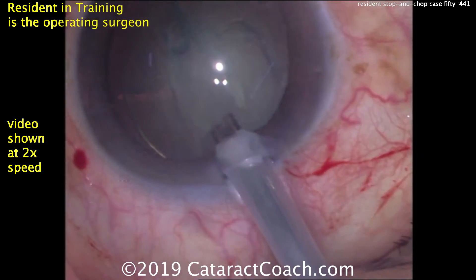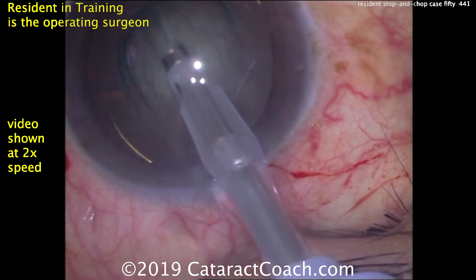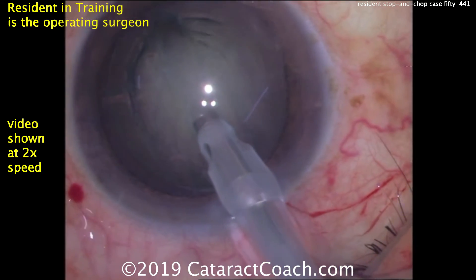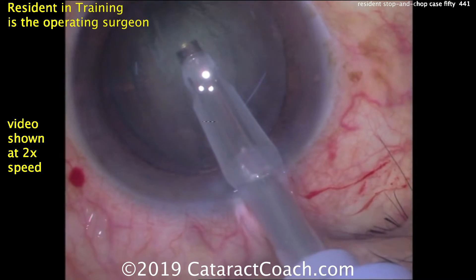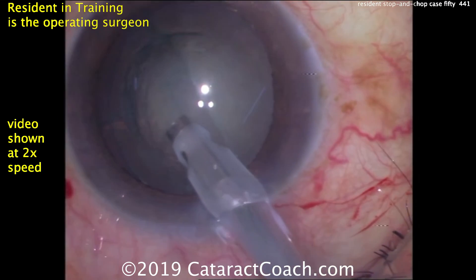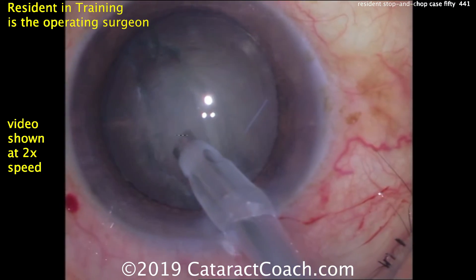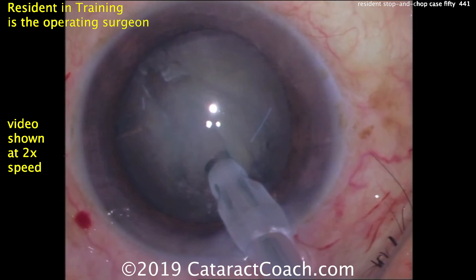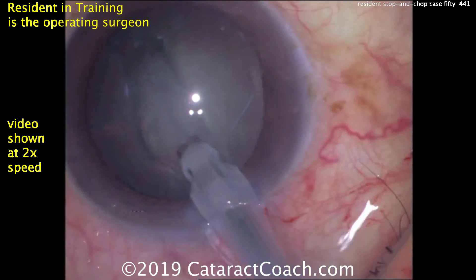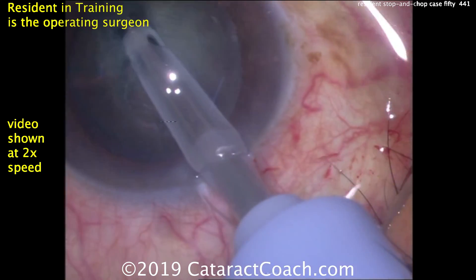The phaco probe is going in the eye — nice reasonable fit in the incision, careful to avoid the sub-incisional iris. This is going to be a stop and chop technique, so there's going to be a nice central groove down the middle of the nucleus. I like that the groove is nicely centered. The nucleus should not be moving — you need sufficient phaco power to keep the nucleus still and keep the eye in primary. This resident has a good grasp that the center of the nucleus is deeper and thicker, and the periphery is more shallow, so the groove needs to be a little bit deeper in the center.